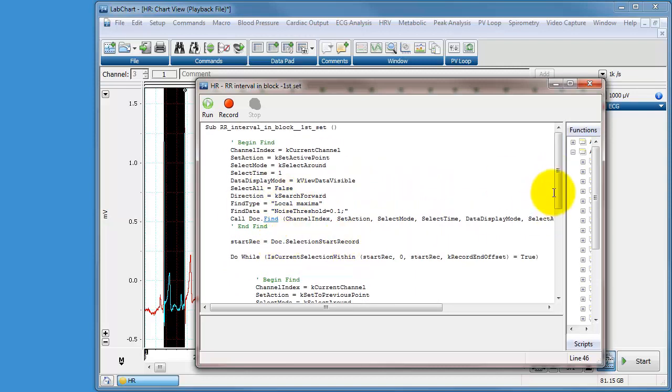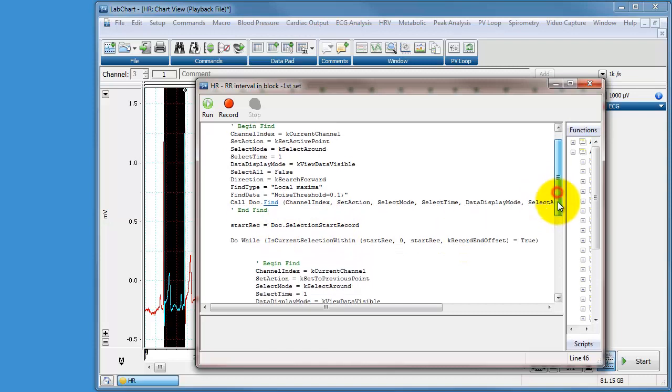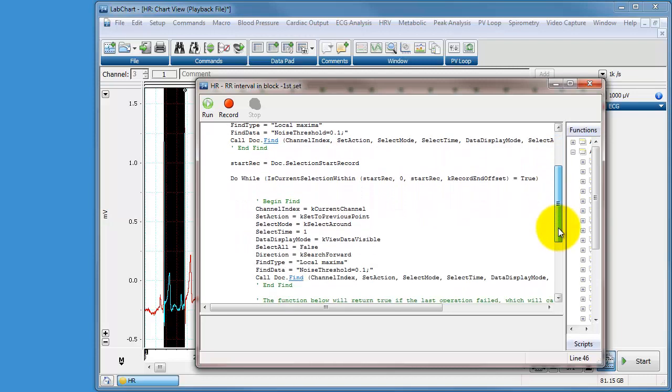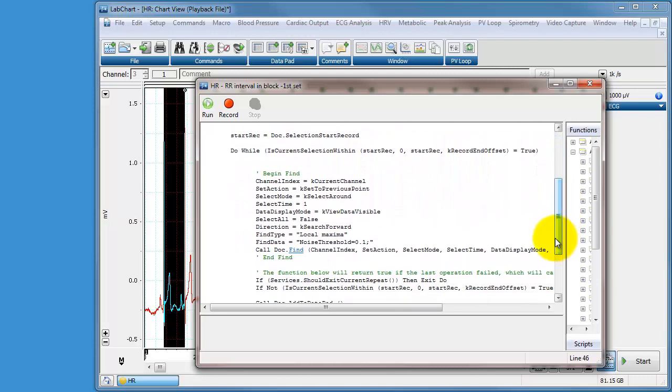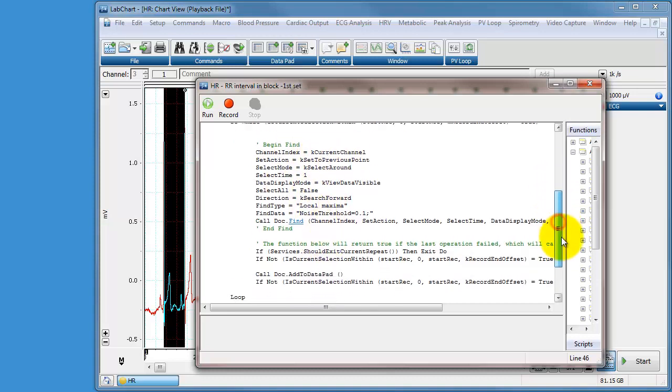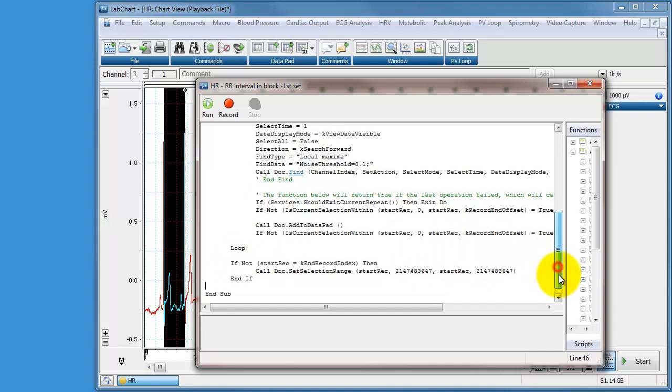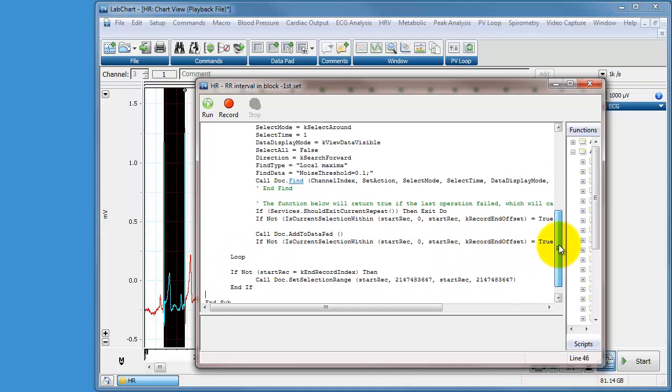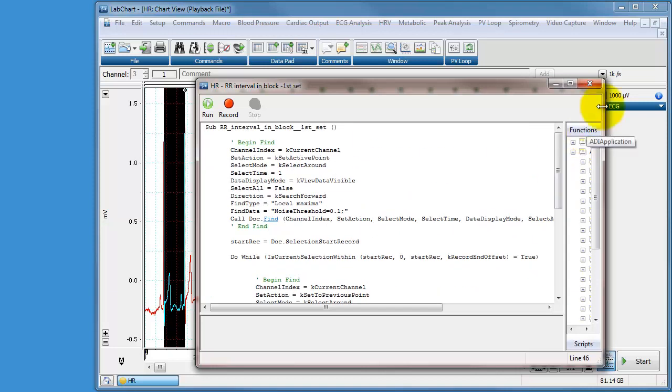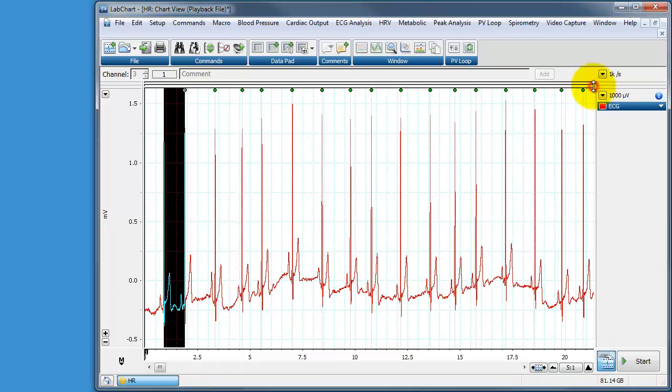Then we've gone back down here. We've done a find command where we're looking for the maxima again and this time we're going to be selecting it. We're then going to add some to the data pad and the loop here is listed. We're going to loop until we get to the end of the file. So we can press close.